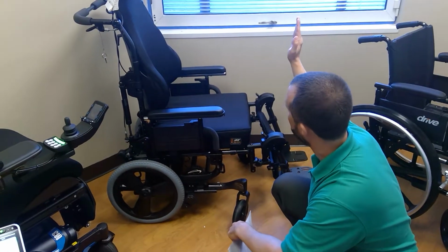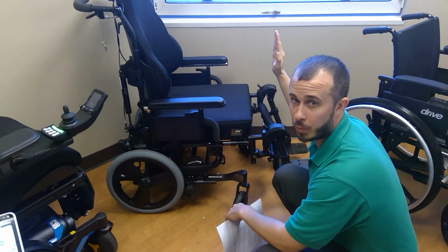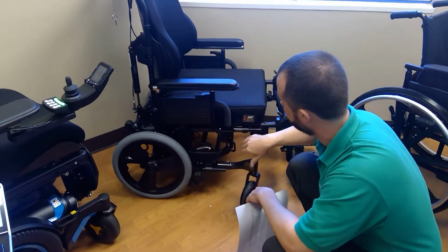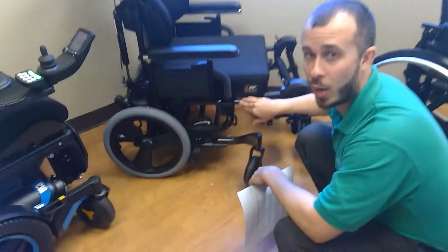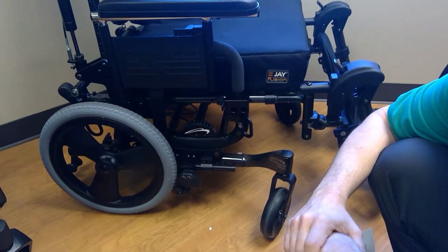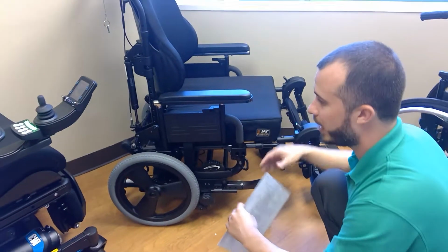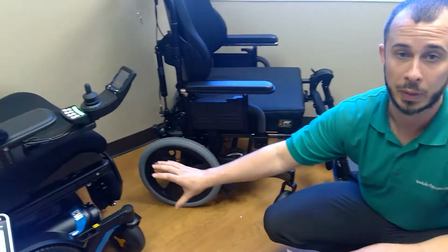So as that device is out here and they tilt the chair back, we want that device to move with the customer, okay? So you would want to pay attention to the different areas on here, find out where we want to mount to, and verify the size of the tube, and then build your mount out from that area. All right. So next we're going to talk about some power wheelchairs.